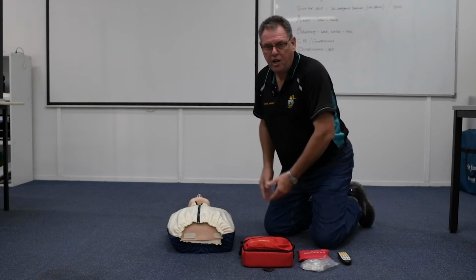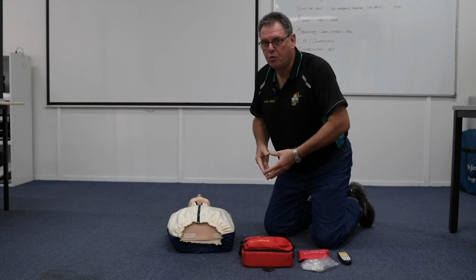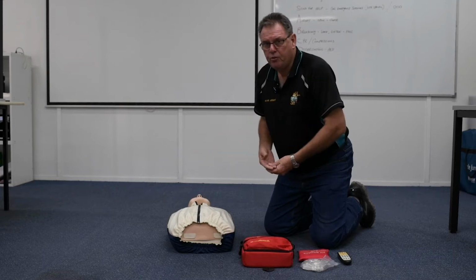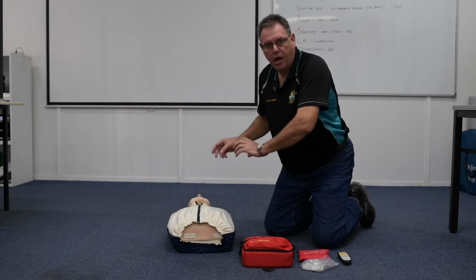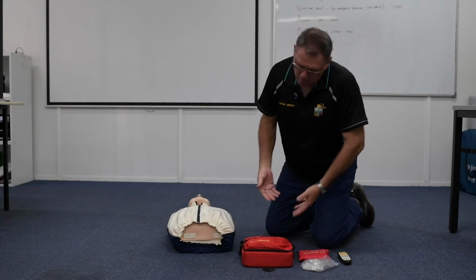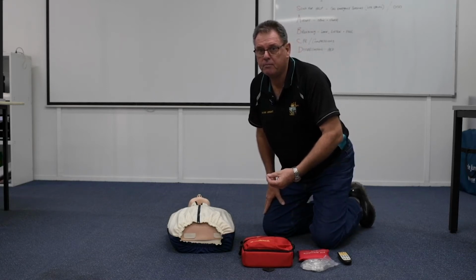In this video, we're going to be talking about using the AED, the automatic external defibrillator. For the purpose of this video, I'm just going to run through some of the important features, and then we'll go through a whole scenario using the AED. The machine will give us instructions, so we need to turn it on and follow the prompts.